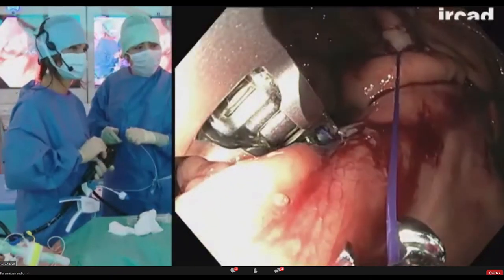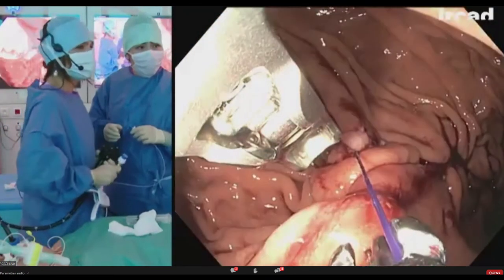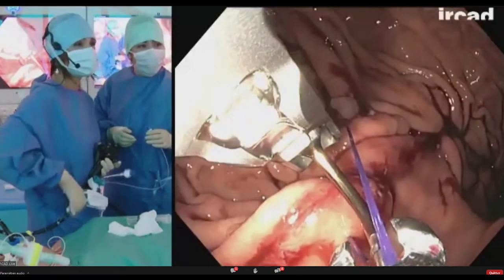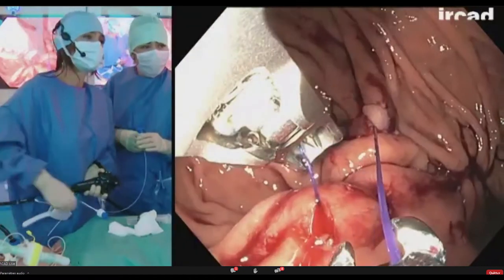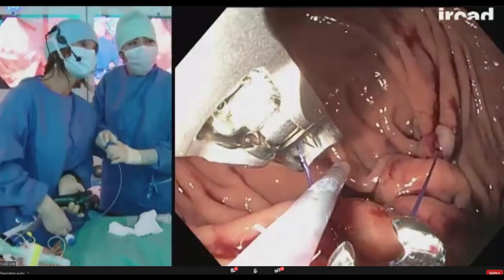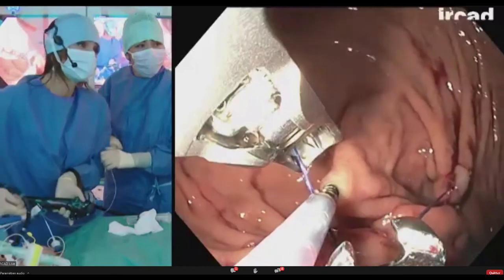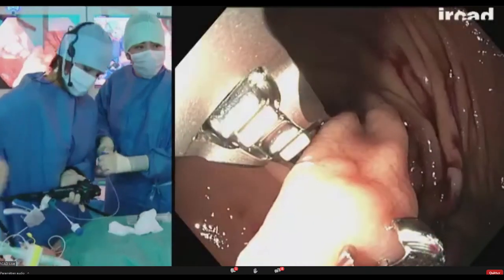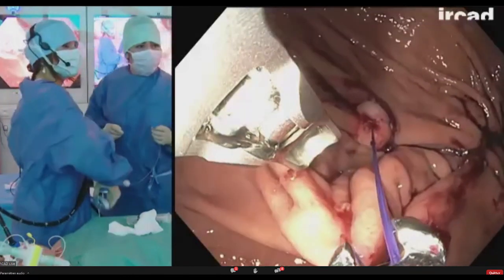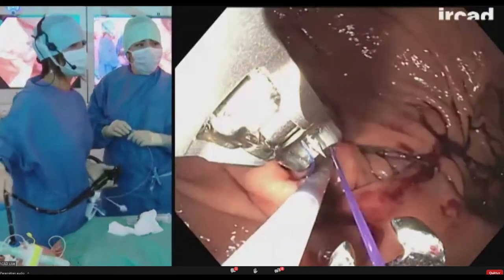Okay. Awesome. Very strict. But I think there is a role, and if I'm not wrong, Manuel, you and I have always been advocating the second chance, the chance of repeating this procedure. It's endoscopy. In a lot of other procedures, for instance, nothing to do with obesity, like ablation of Barrett's by radiofrequency, we know that we go different times to achieve the results that we want. So it's not shocking to me if this is an ambulatory procedure, and in some patients we can do it under sedation, to repeat the procedure. Of course, there is a matter of costs, but it's much less aggressive than surgery, and results of repeating this over time, especially when you start with a very high BMI, can be very good.